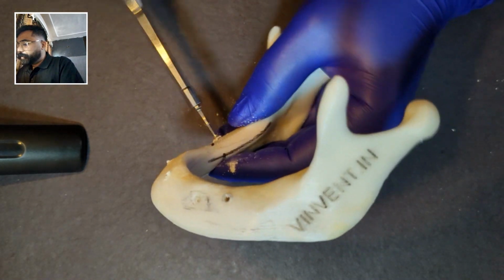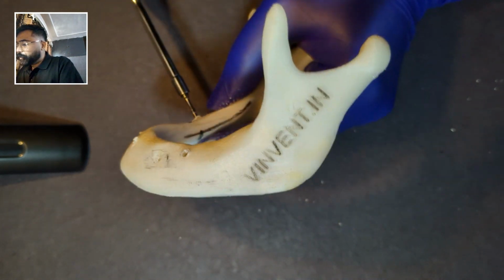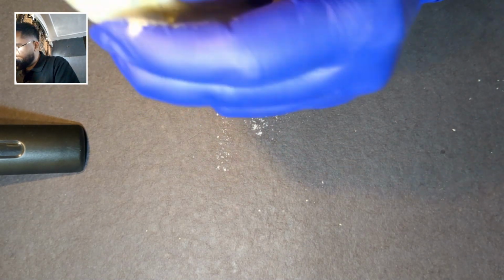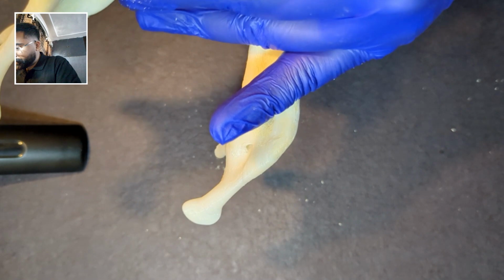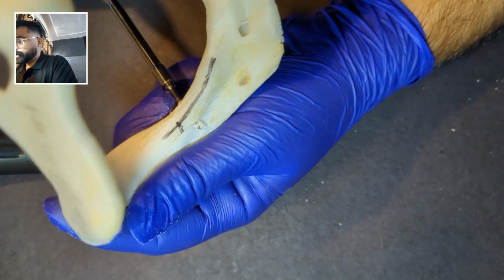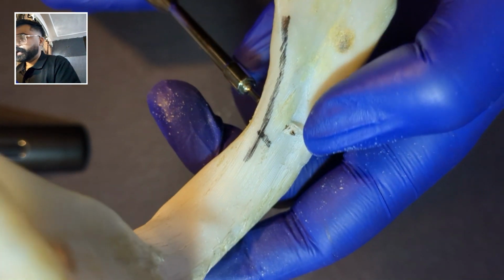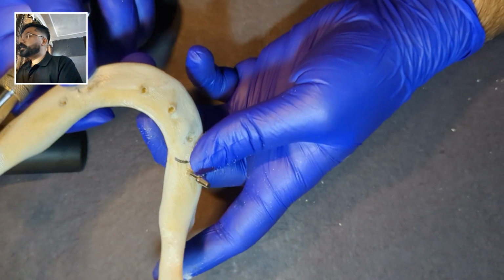And I will stop when I feel the tip of the implant emerging just below the mylohyoid ridge. Everyone can see the implant is now coming out of this area. This is a plastic model, so the plastic is stuck there, but now we are able to see, right? The tip has just emerged just below the mylohyoid ridge. Now I have engaged the lingual cortex.